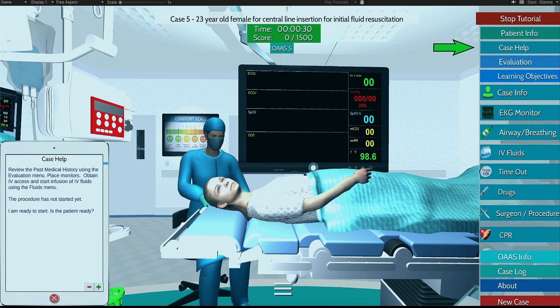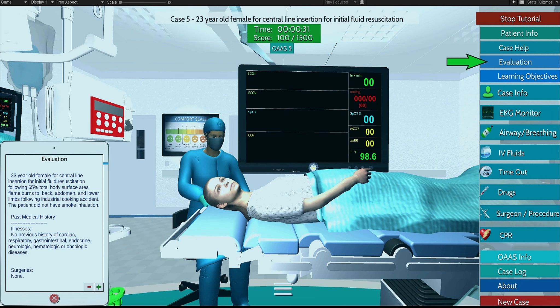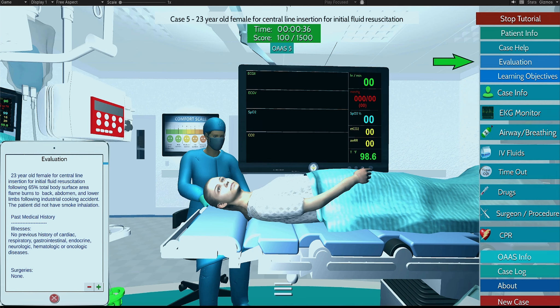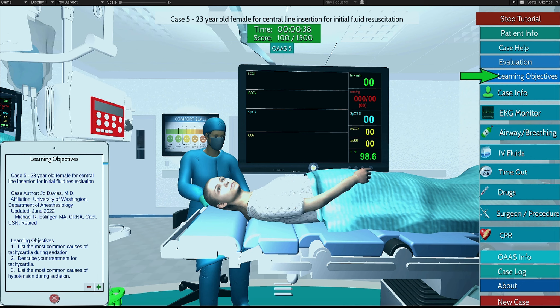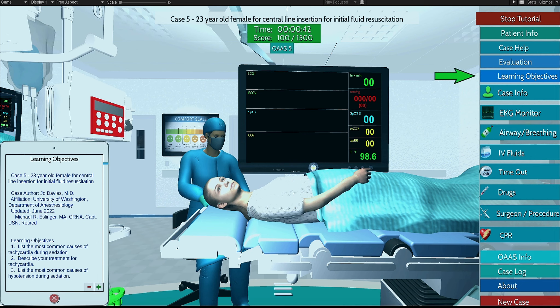This is your patient evaluation, which contains physical exam, symptoms, and past medical history. This is your learning objectives, which contains info about the case with suggested sedative agents.